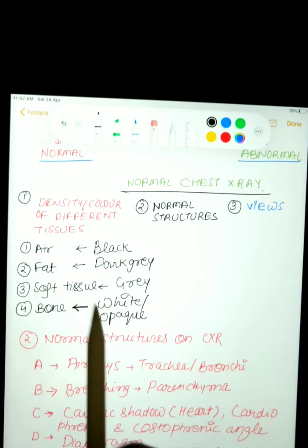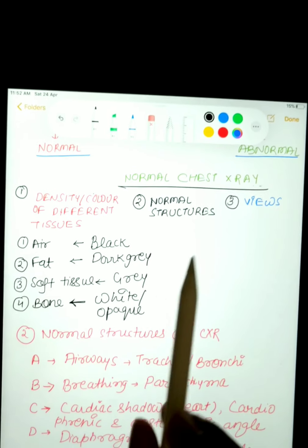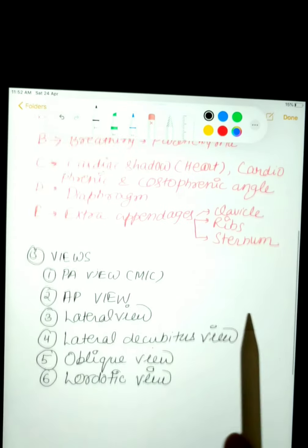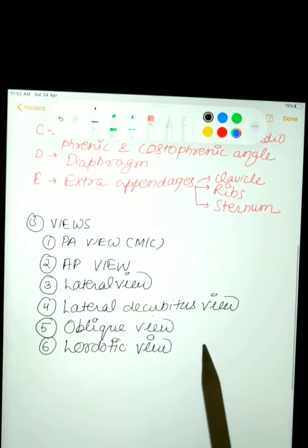I will show you each and everything one by one — first the density or colors of different structures, then the normal structures, and then the normal views.